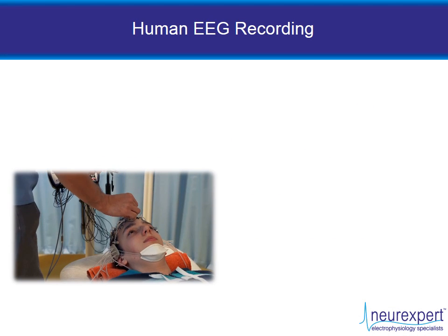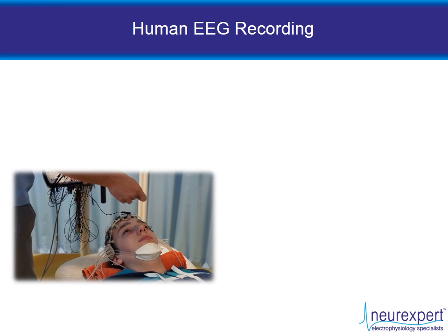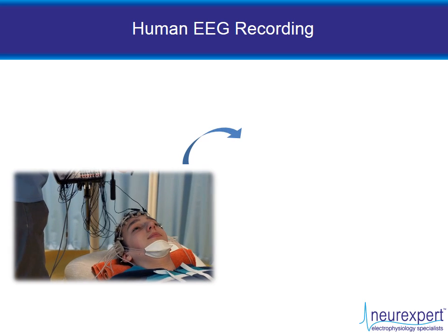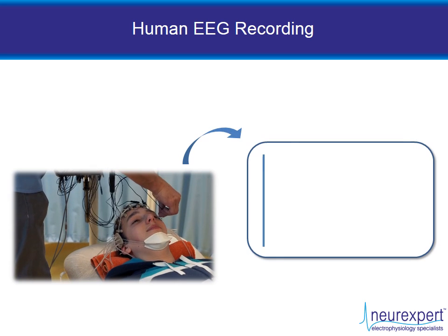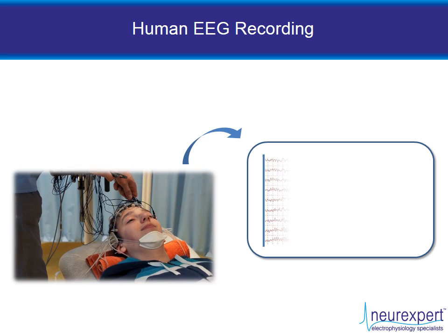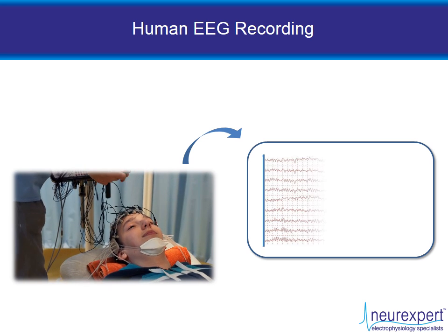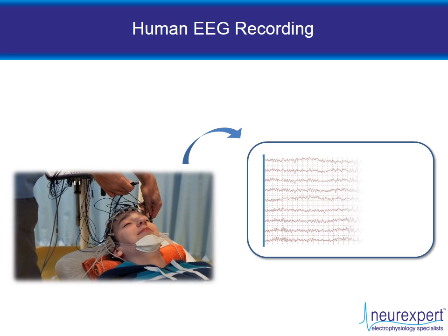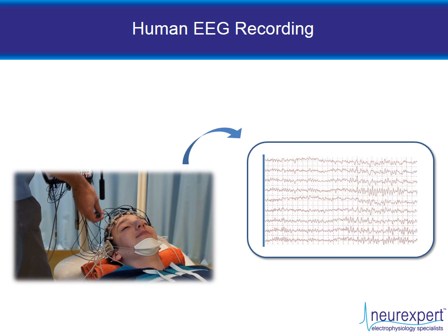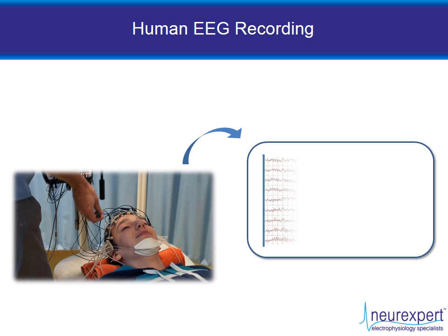In humans, the electroencephalogram is a non-invasive method to record electrical brain activity. This method is extensively used for research and diagnostic purposes in a wide range of neurological and psychiatric conditions. Such recordings can show specific rhythmic activity that can be characteristic markers of behavioural states or disease conditions, and an example is shown in the chart panel on the right.